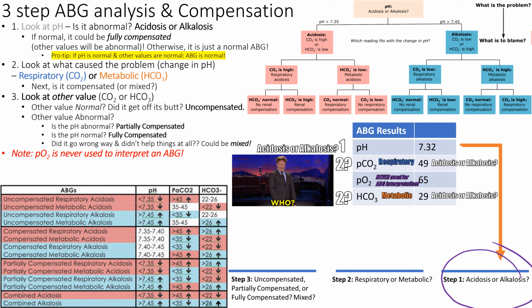That CO2 did, right? That CO2 is 49, the bicarb is 29. Bicarb's a base, and if you have too much base, you're too alkalotic, right? Either way, we have a CO2 that is on the acidotic side. Too much carbonic acid, too much CO2 circulating around. Are they breathing fast or slow? They're breathing slow. They're hypoventilating. They might have any one of those other reasons that cause hypoventilation. So that's what caused it, so you have respiratory acidosis.